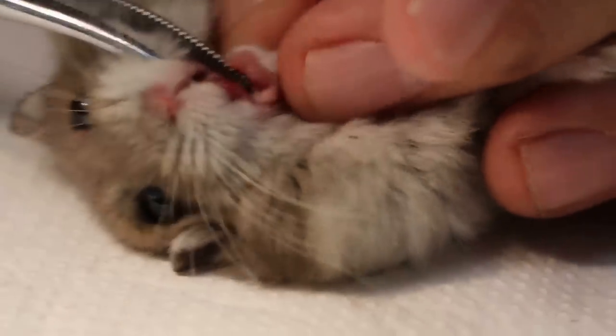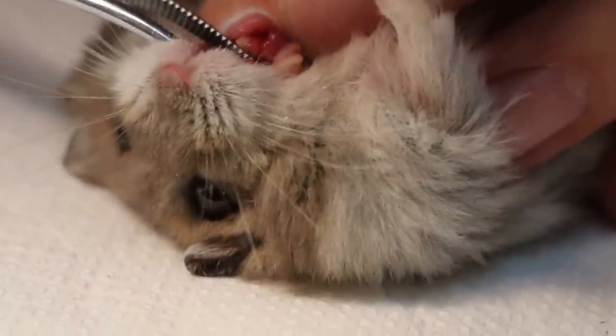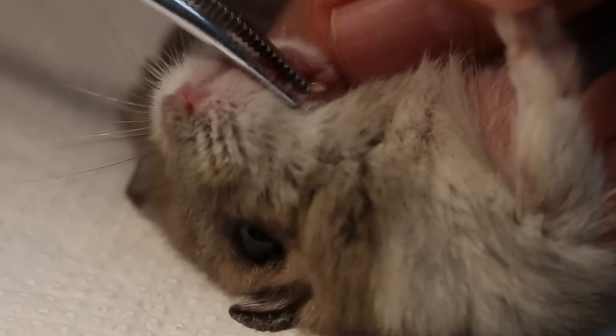So we have a video — video it now. And the tongue, the tongue is quite big actually. This is an old hamster. Now the lower tooth is short, so I don't cut it. You can see it passed here and there.